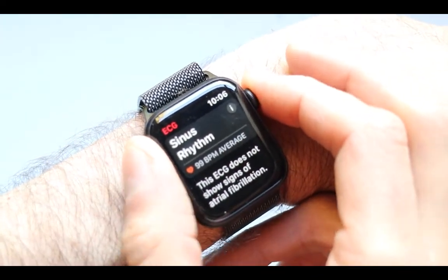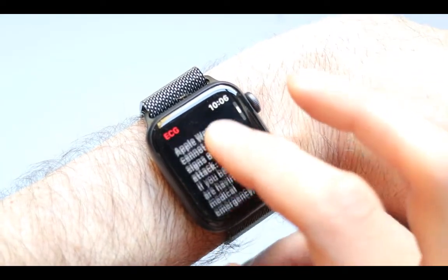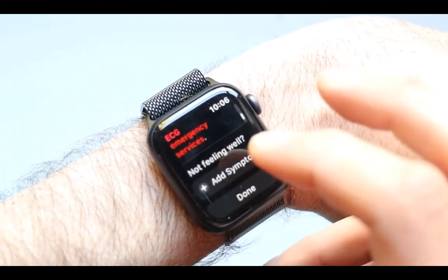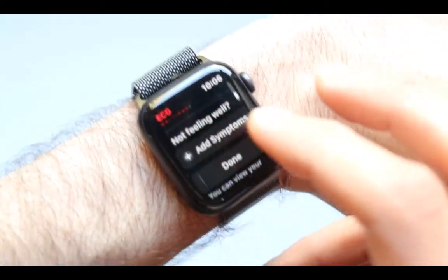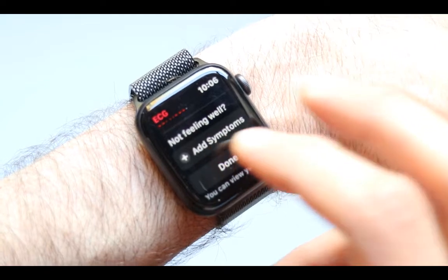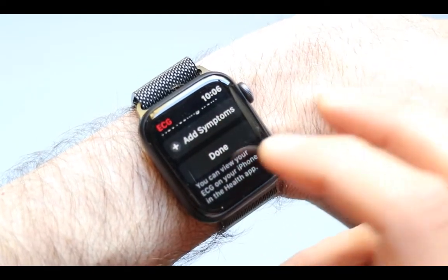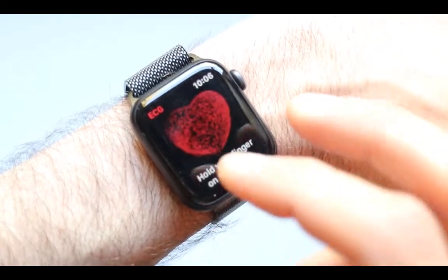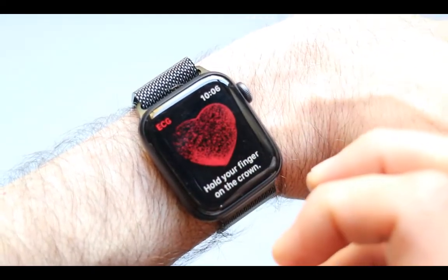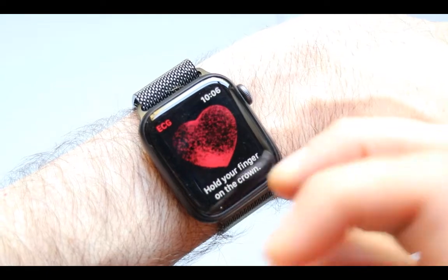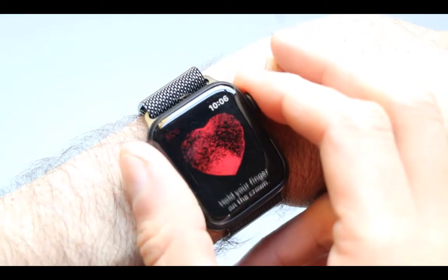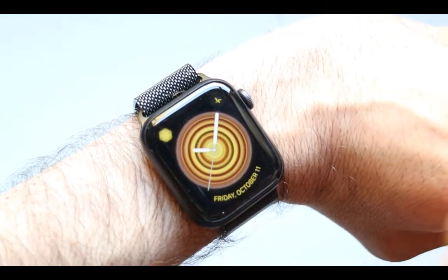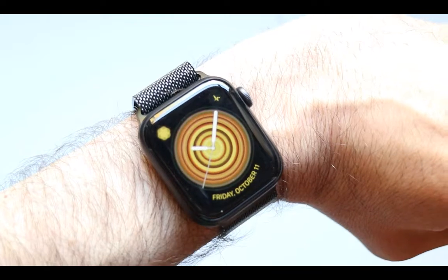So that's how you go ahead and set this up and it's going to keep a watch for you. If you're not feeling well, you can add symptoms right here and press Done. Now you're going to have a report of your EKG, and you can do this any time you need to run it again.